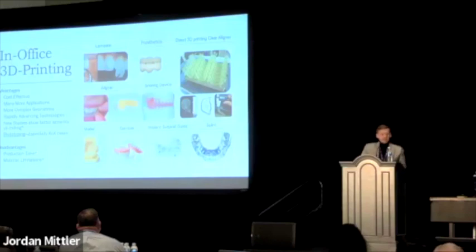Obviously, there are guides. I don't use them for that, but that's a very common use for printing. And so on and so forth. There's just a ton of options, and production time and material limitations have an asterisk, because that's quickly disappearing.